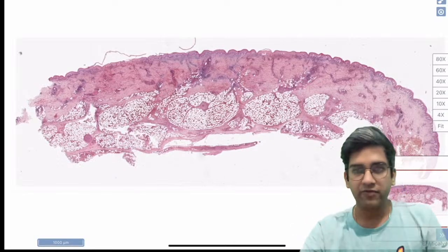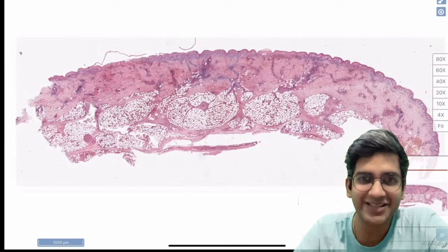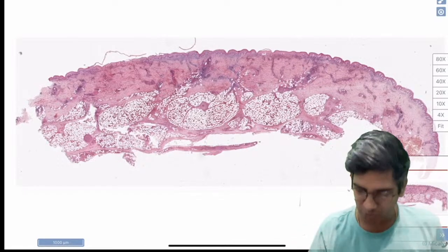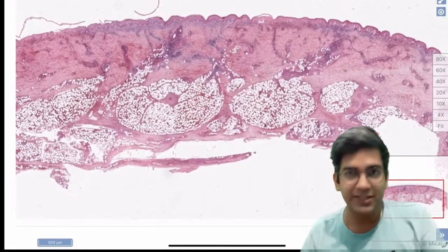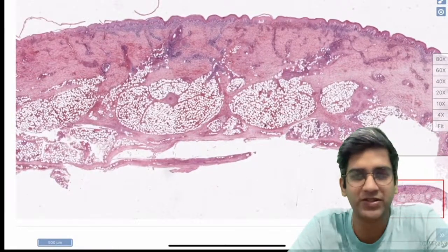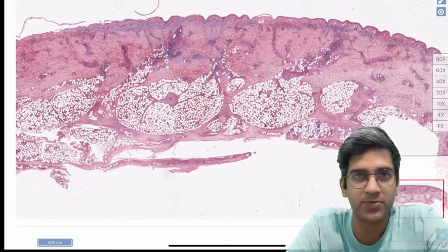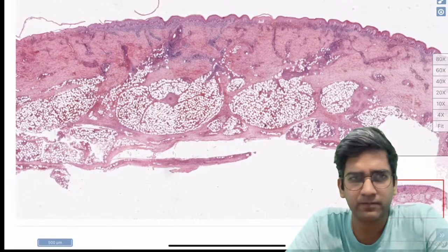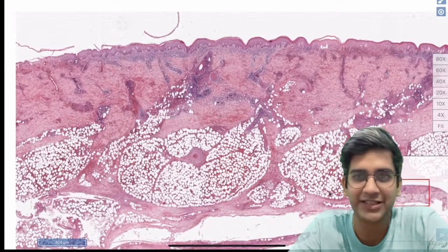Great, amazing. Fine. So for starters, what biopsy is this? I know it's a very simple and silly question, but I want you guys to get excited and start the drum roll going. I want you to answer what biopsy it is, so that some things come very easily. I think this should be simple enough. That's a biopsy of the skin, right?